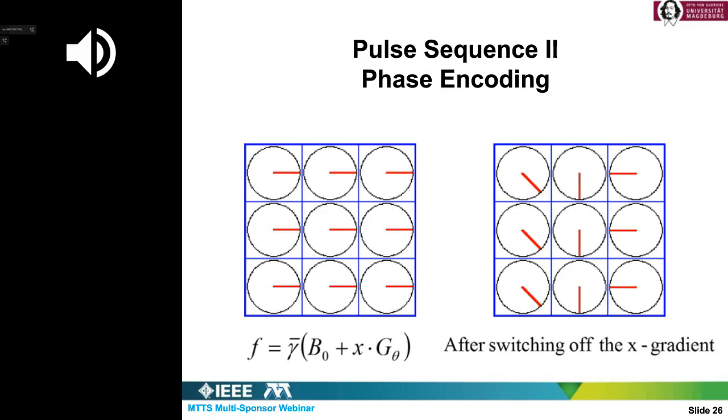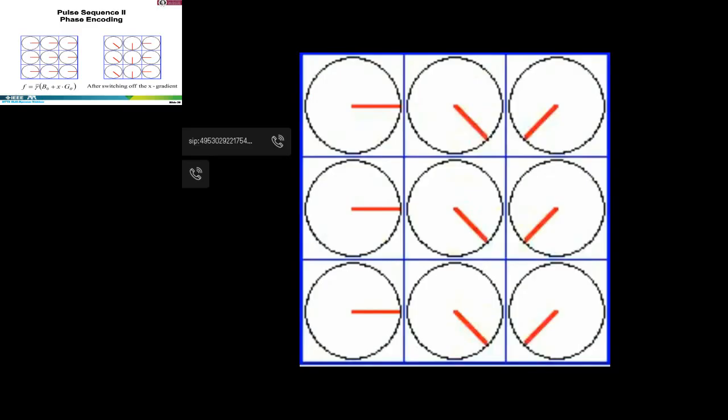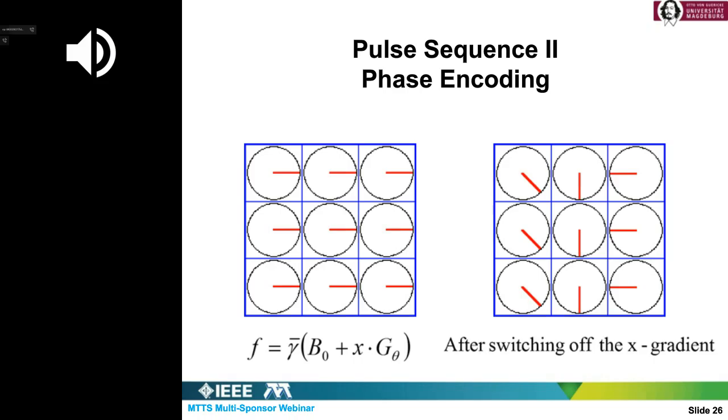And then afterwards, you stop this exposure, and you restore the Larmor frequency over the entire cross-section, but they are dephased now. As you see, they rotate along the x direction with the same Larmor frequency, but with different phases. So this way, we could assign a certain phase for each x value. So first, we picked up a slice. This is the Z ramp. The second step is to create a dephasing in the x direction. This is a phase difference, which is related to the x values.